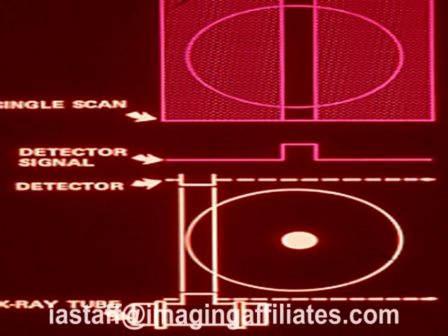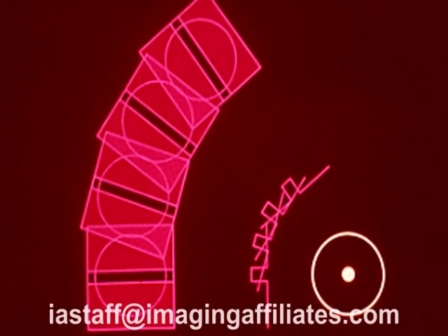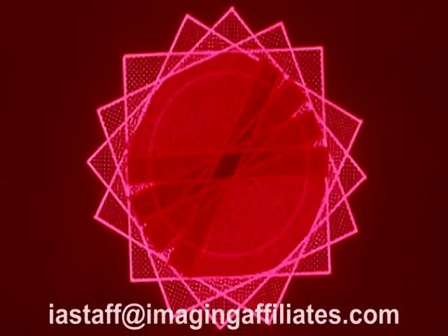Since the discontinuity from the central object can only be localized in one dimension by a single scan, it is back projected across the entire field. A series of back projected profiles of the same field are generated, rotating the X-ray tube after each traverse. After a sufficient number of single scans or views are accumulated, they can be superimposed to reconstruct the original field.